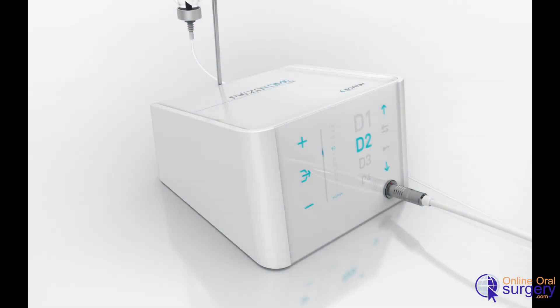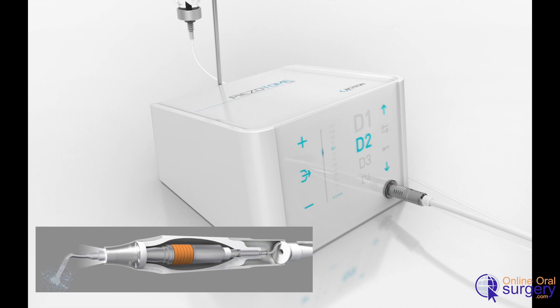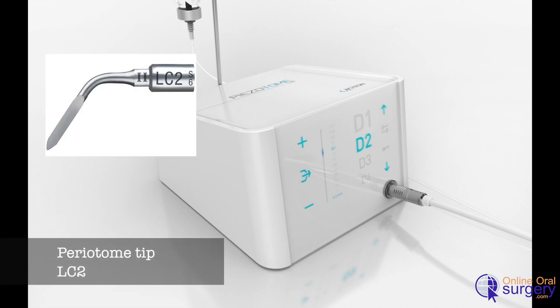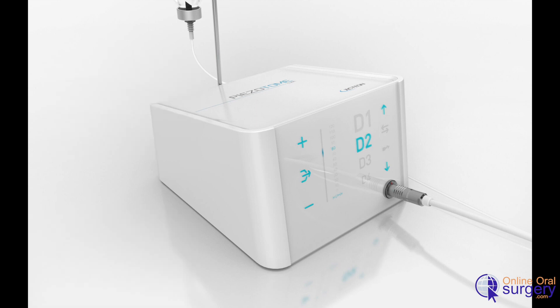In order to separate the root from the alveolar bone, we're going to use our piezotome cube. This is essentially an ultrasonic device that has multiple different tips we can place in it that vibrate at ultrasonic speed, which are designed to cut hard tissues but spare soft tissues in the process. I use it quite frequently for bony surgeries such as sinus lifts, ridge splits, and for harvesting bone for augmentation. In this case, we're going to be making use of the periatome tip, which looks very similar to a periatome. It's got beveled edges on the leading and back side as well as at the tip, and is used to sever the periodontal ligament circumferentially around the root to facilitate atraumatic removal of what remains of the tooth.